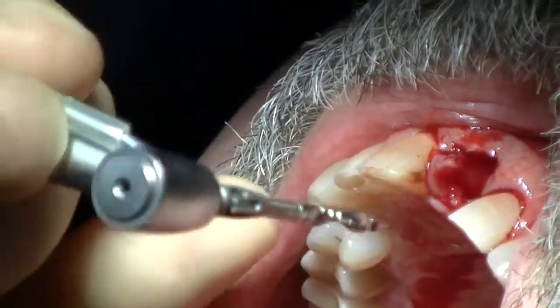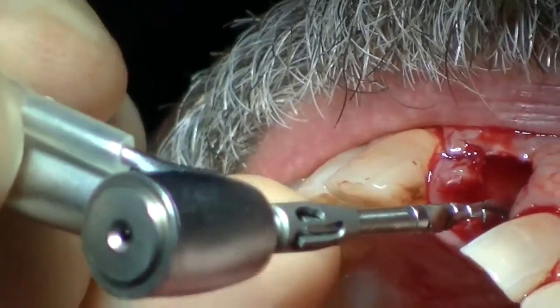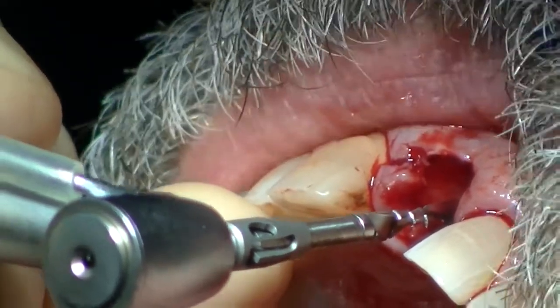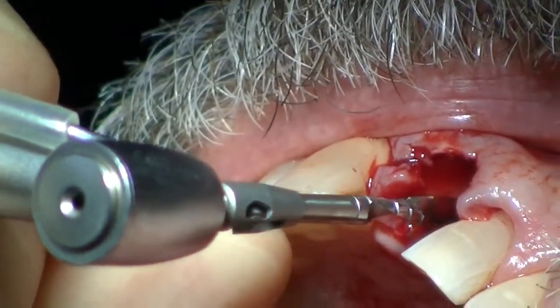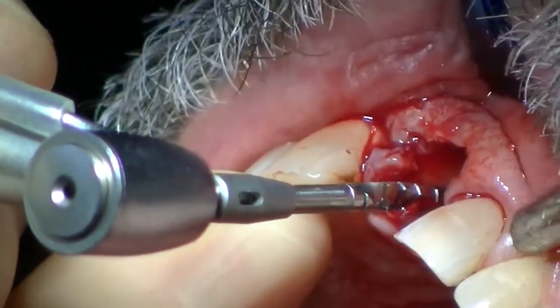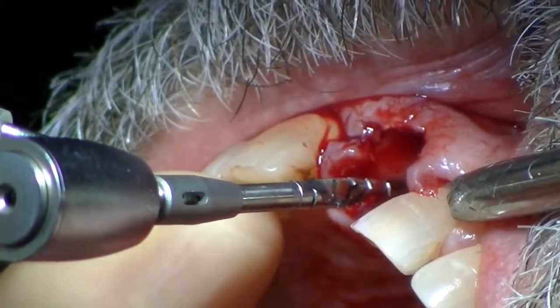So if I could leave you with one thing here, it's imperative that we have complete control. You can see, hard to see on the video, but I'm looking at the tooth first, getting my angulations just right, and I'm going to engage that palatal wall. Turning my handpiece back up to 800 RPM. 3 millimeters palatal to the facial aspect.